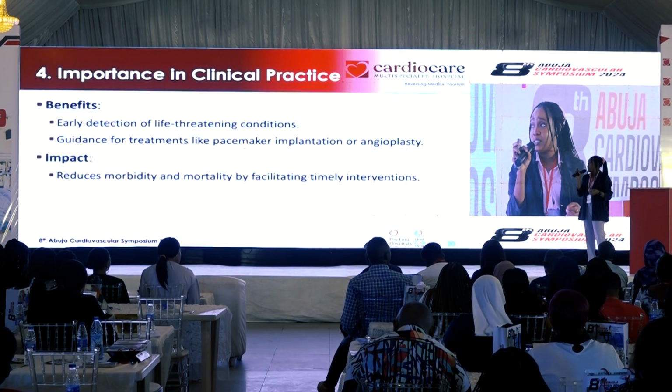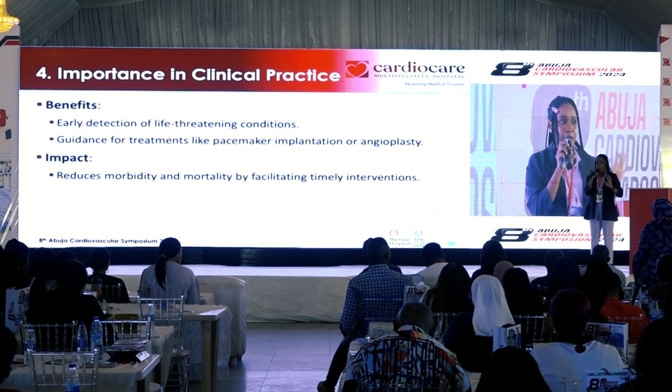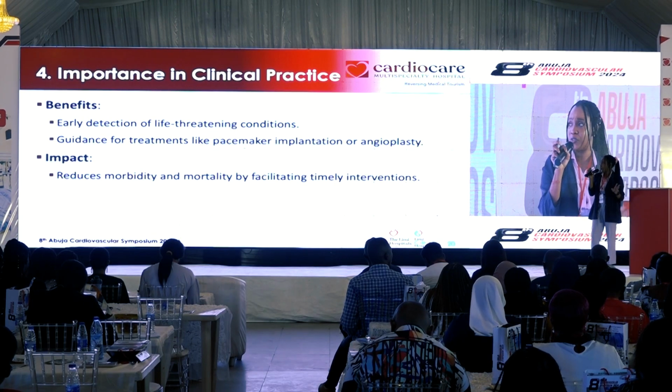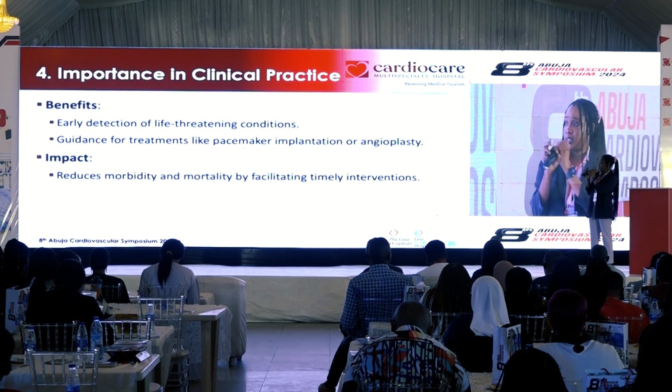I remember like 2 days ago, a patient came in and we did just an ECG and we had to activate the cath lab because they saw some STEMI on his ECG. So it's very important in detecting life-threatening conditions. Please, any patient that complains of any particular chest pain or any type of discomfort, it's very important that you run some of these tests for them.